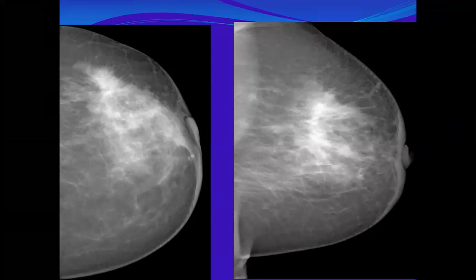Continue. This is craniocaudal, the left craniocaudal. Okay. No, these are two views, craniocaudal and mediolateral. This is suboptimal positioning. See, when the breast is edematous, you expect a problem in the positioning, because the patient will not tolerate the compression and positioning. It demonstrates asymmetry at the lateral part of the breast with associated architectural distortion, skin thickening, and nipple retraction.